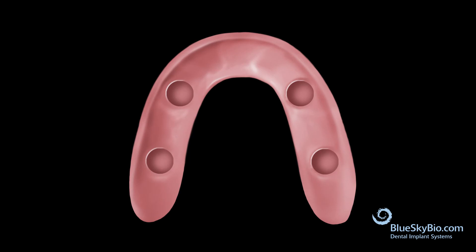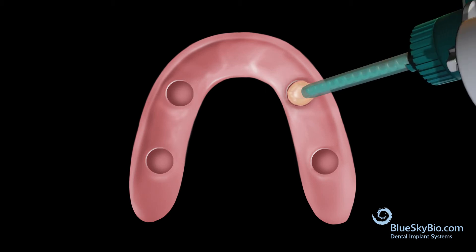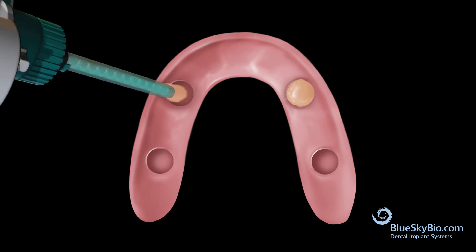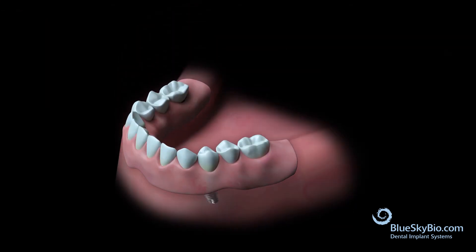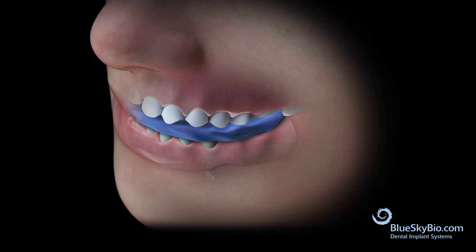Clean and dry the denture thoroughly in preparation for housing pickup. Mix the pickup material per manufacturer's instructions and fill the wells. Dry the housings in the mouth, then seat the denture in the mouth. Insert the bite registration and have the patient bite into occlusion gently while the material sets.